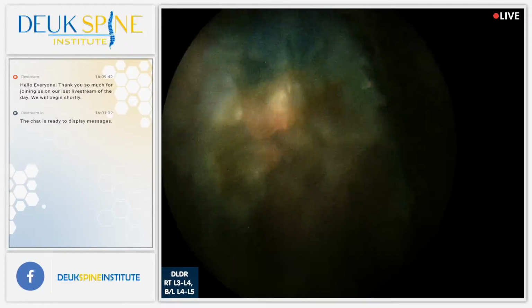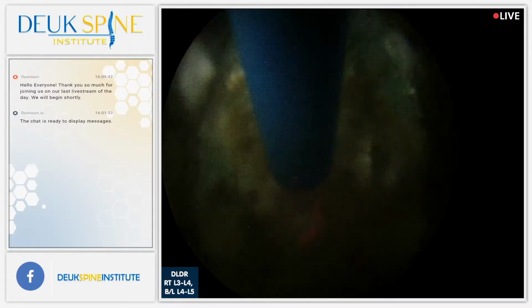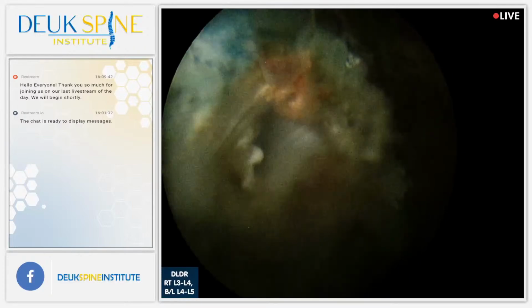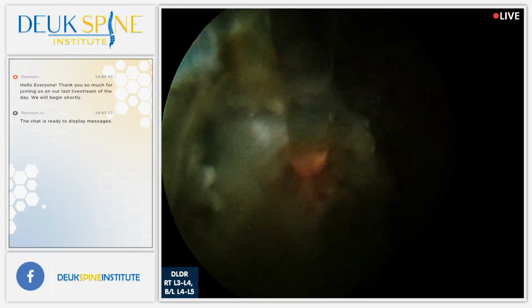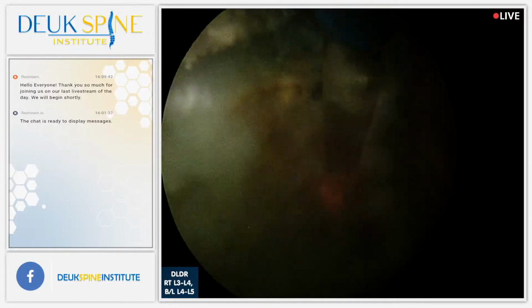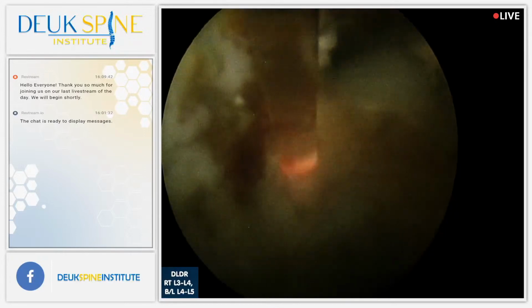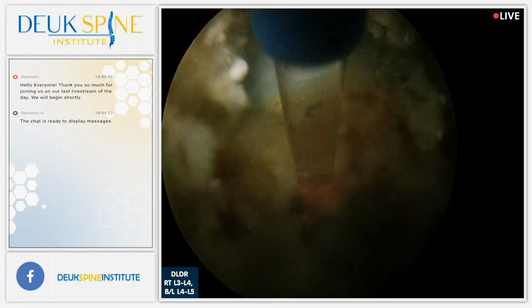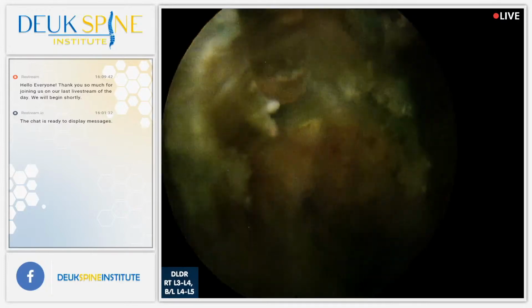You can see the damage to the disc. The damage that I'm seeing here is clearly older than 5 months. But her symptoms got worse about 5 months ago. And that's probably because she had some more herniation happening. We need a blue towel there.